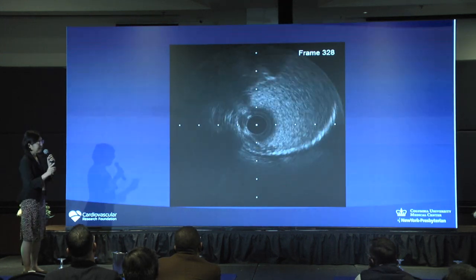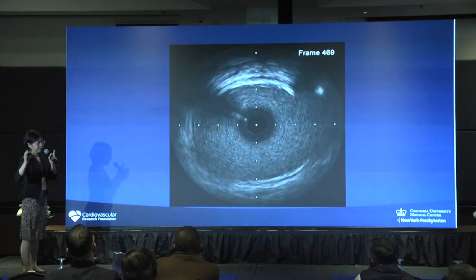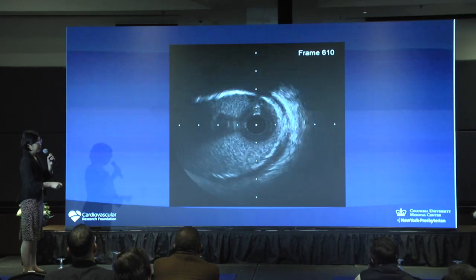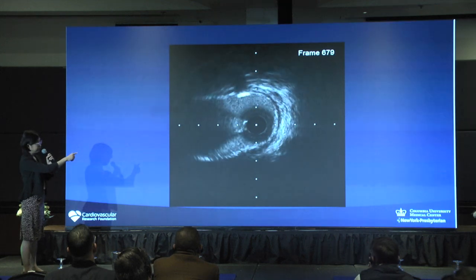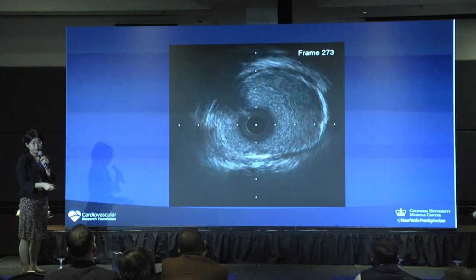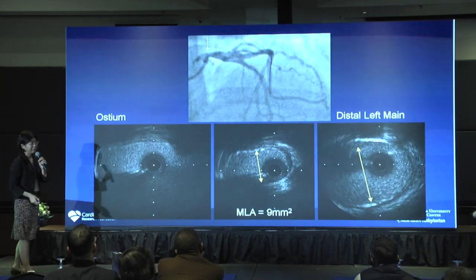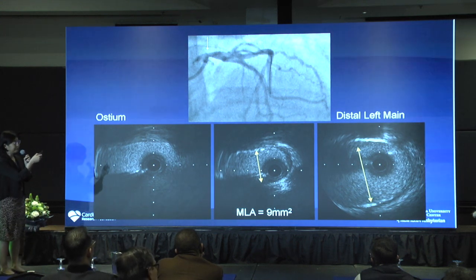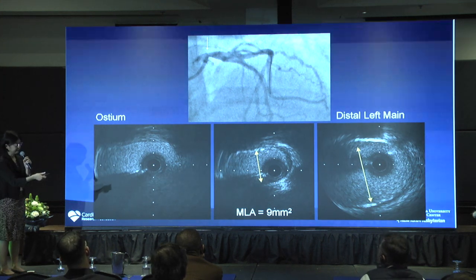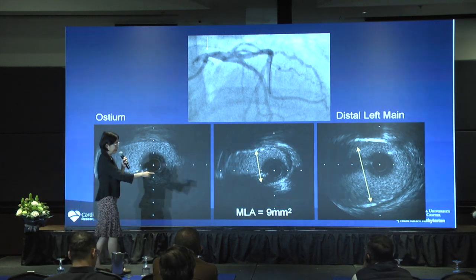One more time. Number one, this IVUS picture is not great because we are almost out of the field of view, so we have to change the zoom before starting. Number two, we come back to the ostium because our interest is the ostium, so we have to disengage the guide to see the aorta, right? So this is a summary, and you see this IVUS was not great, but we confirmed the connection to the aorta, and when we analyzed, the minimum lumen area at the ostium is 9.